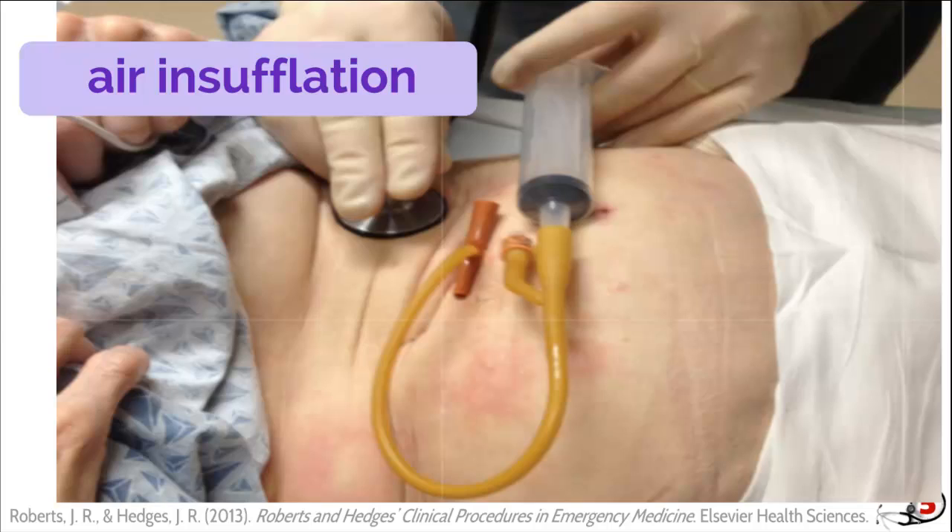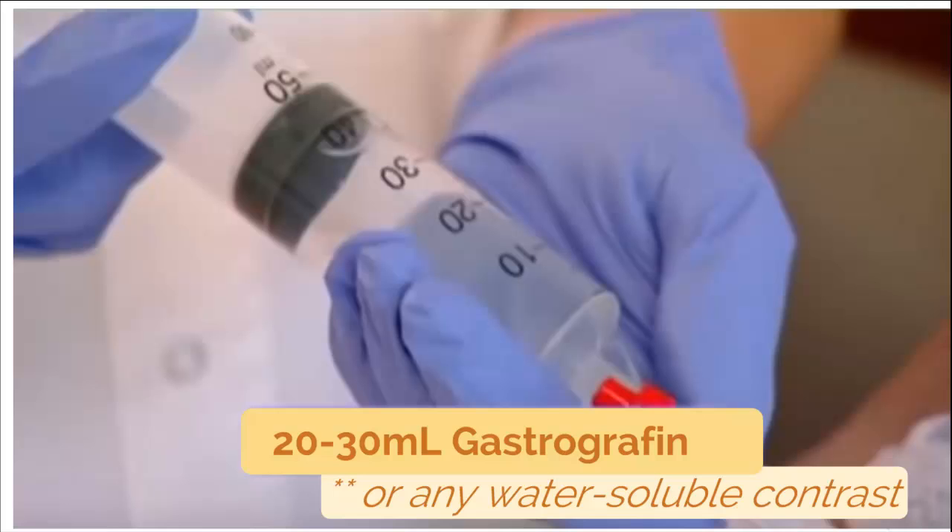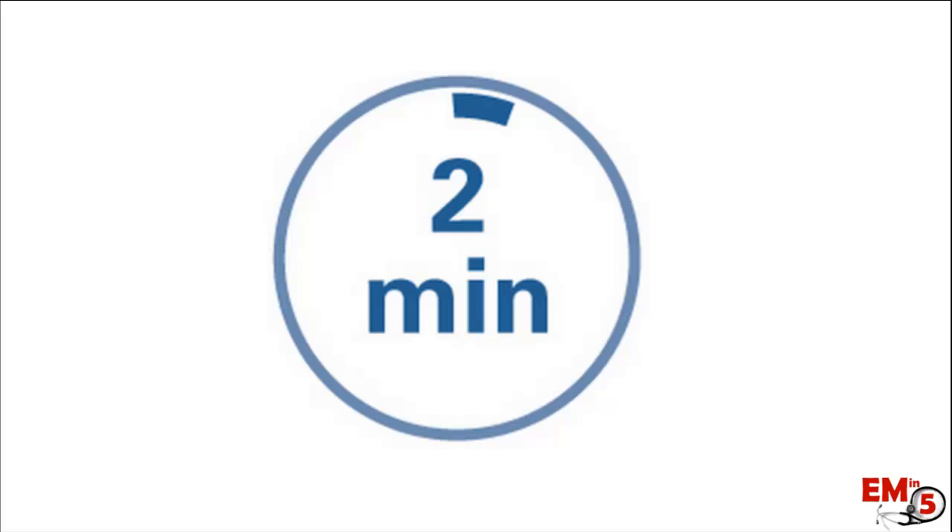So how are we going to verify that the tube is in the correct place? One thing we can do is air insufflation and listen for borborygmy, but probably even better is to actually aspirate and see if you can get gastric contents back. Once you have gastric contents in your syringe, you can also double check by measuring the pH. If it's less than 5.5, you can be pretty certain that's gastric contents. If it's greater than 5.5, you should consider doing additional imaging. To do that, instill 20 to 30 milliliters of gastrographin or any other water-soluble contrast, wait two minutes, and then do a supine abdominal x-ray.